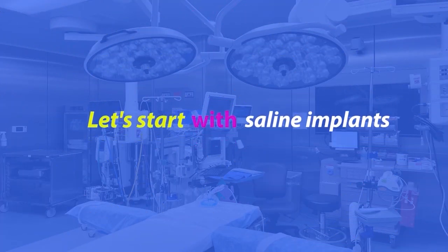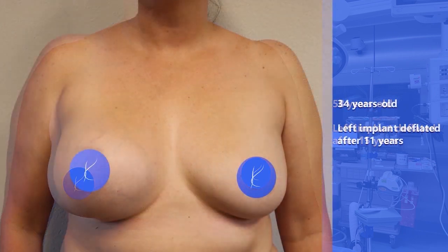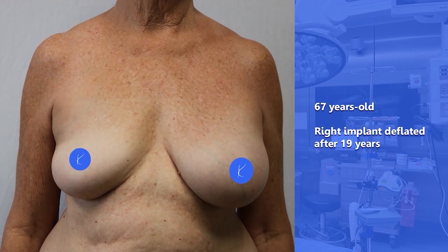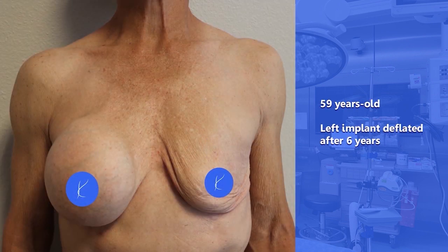Let's start with saline. This 58-year-old had her breast implants for 15 years before her left side leaked. She had hers for 11 years before the left implant leaked. This 67-year-old had hers for 19 years before the right breast implant leaked. She had hers for 14 years before her left implant leaked. Here's a more extreme example — this 59-year-old had hers for 6 years before her left implant leaked. You can imagine that sometimes this might be a little difficult to camouflage in clothing.